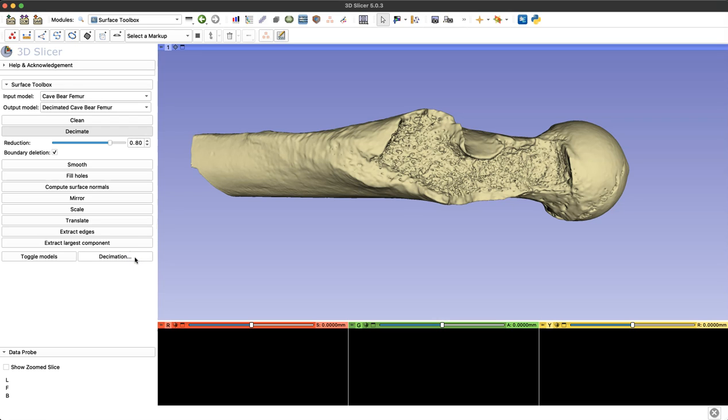Now depending on how big your original file is, this may take a minute or two but generally it is pretty fast. And now that it's completed, you can see our model has changed colors.